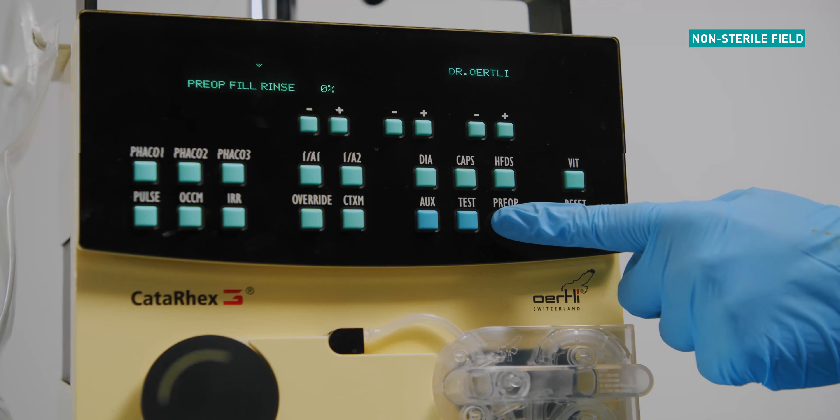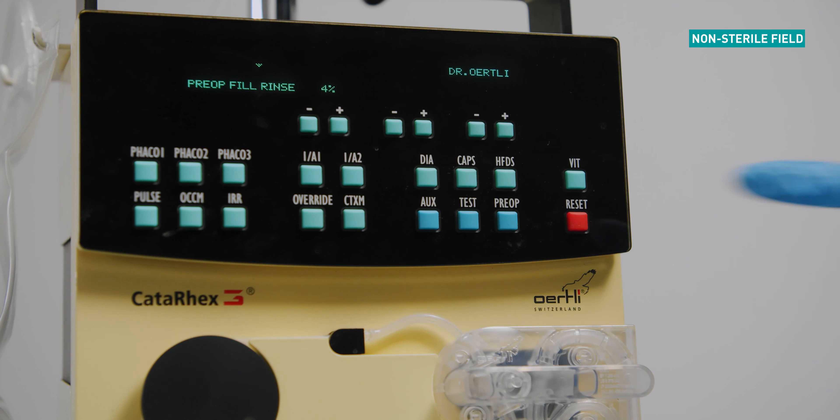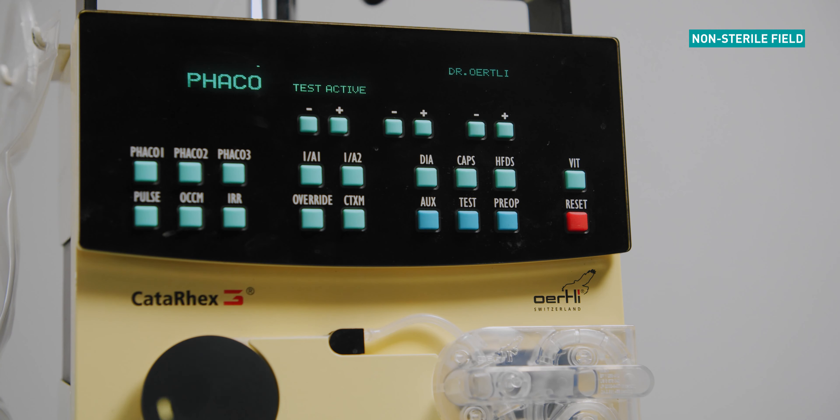Press the pre-op button to start the priming cycle. Allow the pre-op cycle to complete fully — approximately one minute. The FACO test will start automatically after a complete pre-op cycle. Allow the machine to run through the cycle up to 100%. The device is now ready for surgery.